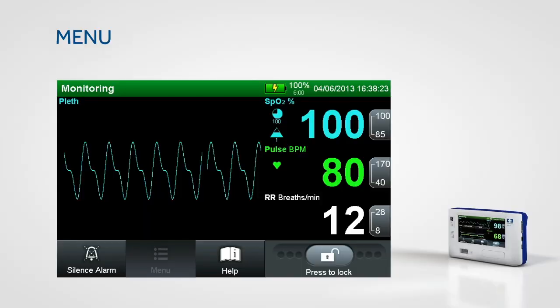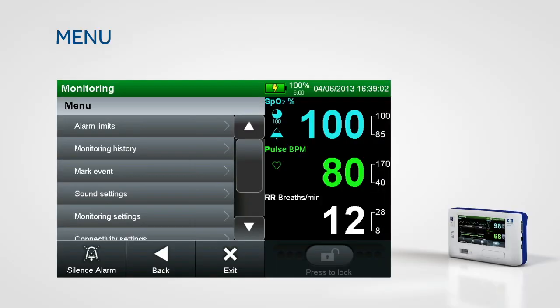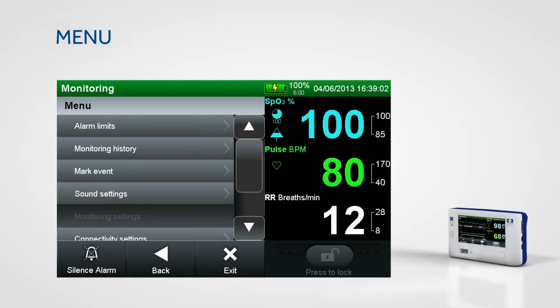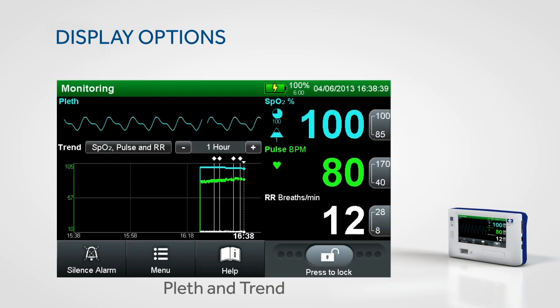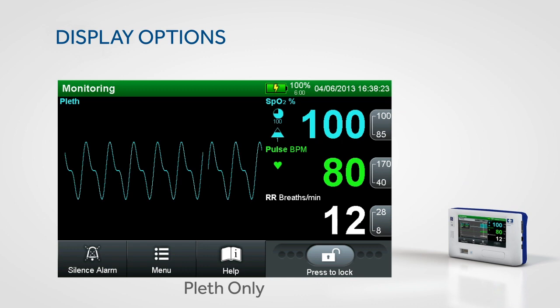To access monitoring layout, touch menu and then touch the monitoring settings submenu. Here you have the ability to choose how the monitoring information is displayed.